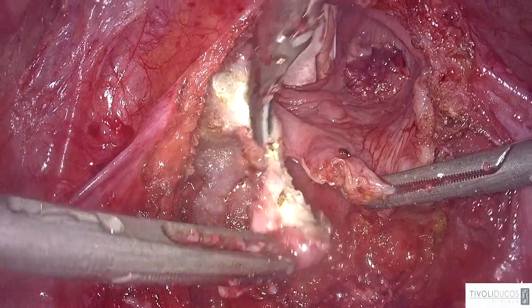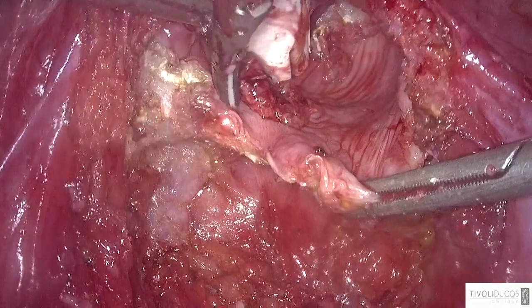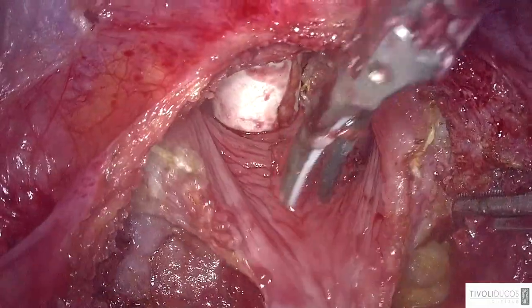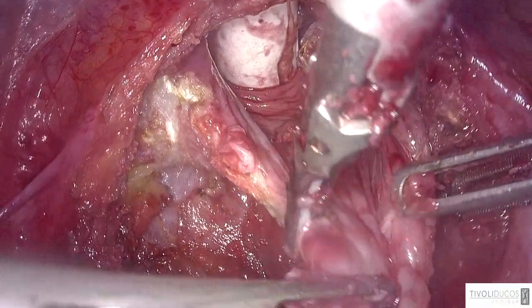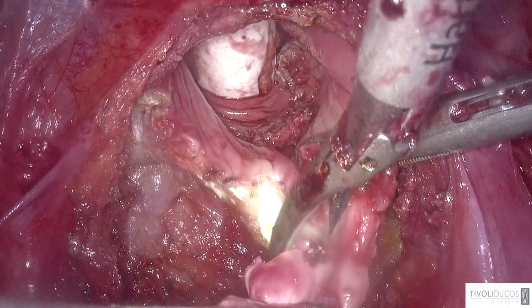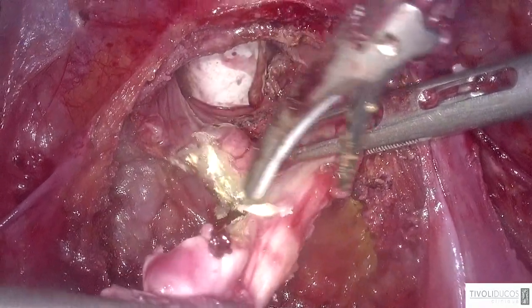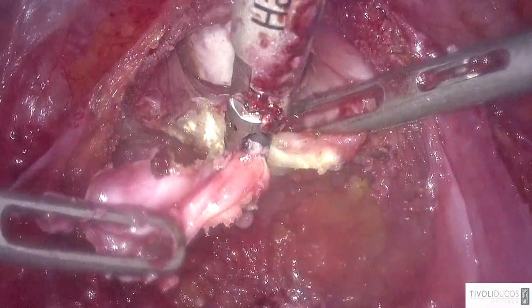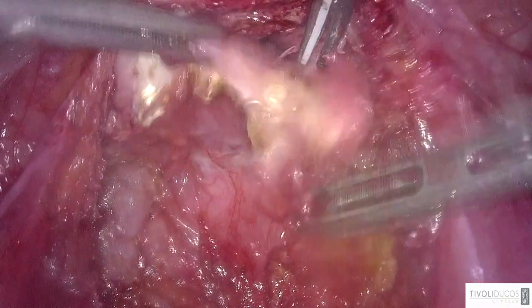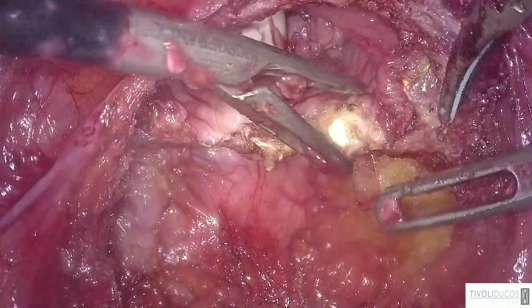No, there is a small cyst inside. You're very right. There is a small cyst inside. Okay, and on the other side, here it is normal. No, maybe we can remove this too. So I put a finger into the vagina to see if everything is okay. Each time you cut, you have to take a look at the tissue, the color of the tissue you leave, and if you have a small black cyst inside, it is very likely that the tissue is not clean, and you have to remove it a bit more.